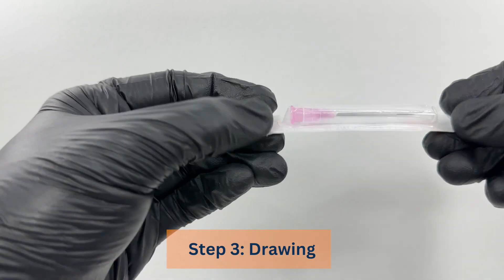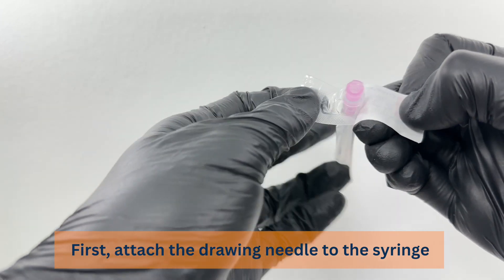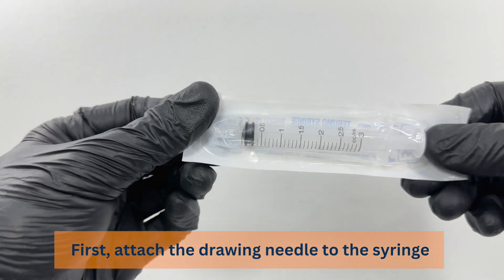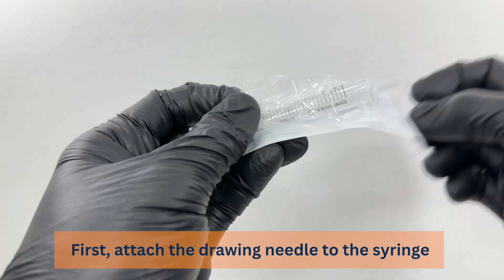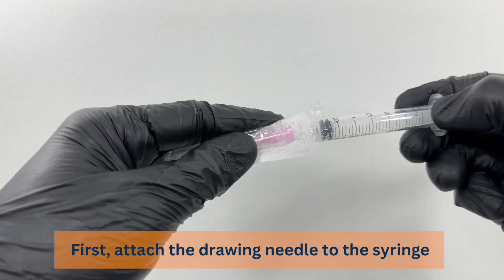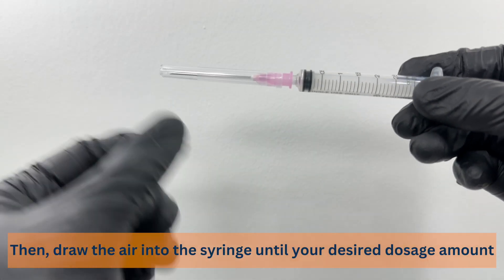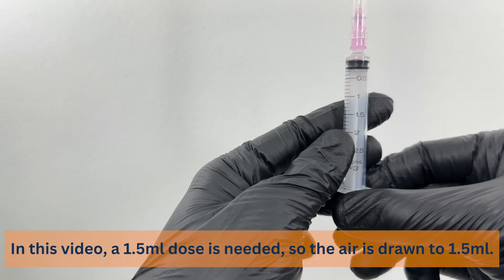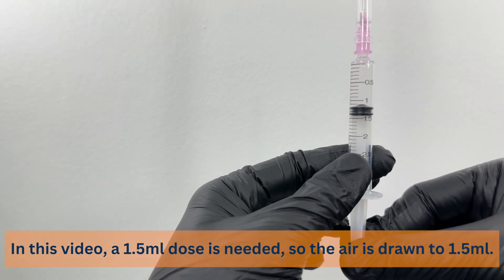Step 3 — Drawing: First, attach the drawing needle to the syringe. Then draw air into the syringe until your desired dosage amount. In this video, a 1.5 ml dose is needed, so the air is drawn to 1.5 ml.